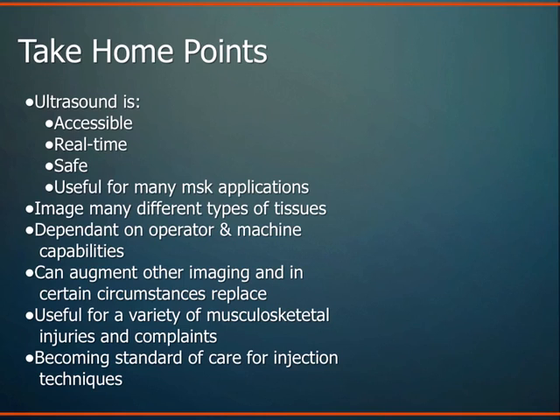So, take-home points for MSK ultrasound. A lot of benefits for this modality, especially in the world of MSK and sports medicine: real-time accessibility, very safe, and it has a lot of applications for MSK imaging. You can image all kinds of different tissues, and it's important to keep in mind, as you're imaging those different tissues and looking for pathology, that you have to realize not only your personal limitations but also the limitations of the ultrasound machine, as you get more and more training and more comfortable with the modality.